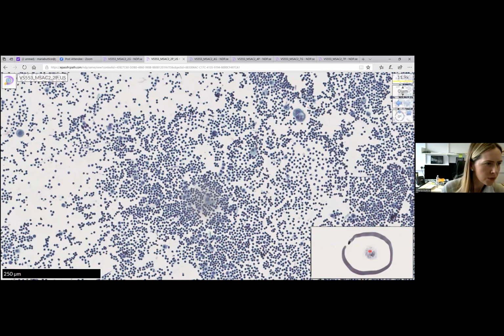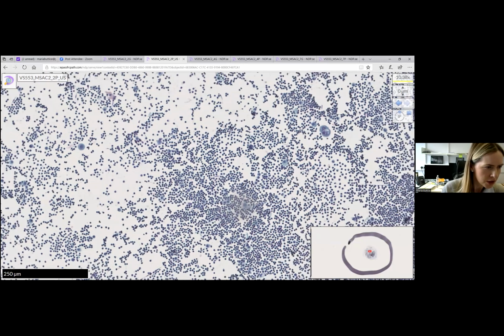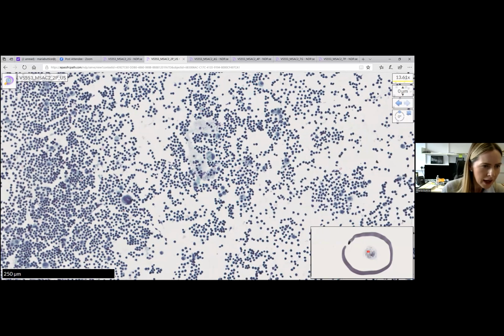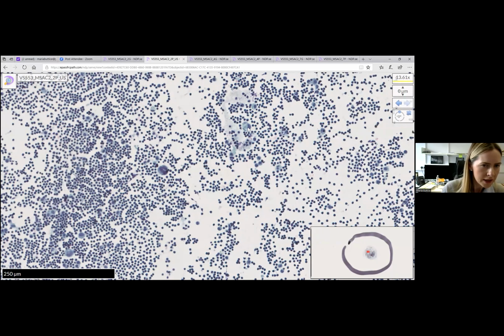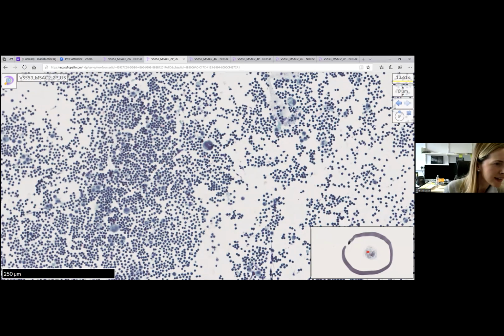So does anyone want to give some, yes, thank you very much, positive for malignant cells? Do you think we can go any further on what type of malignancy this may be and why? So just reminding of the cytomorphology. Fantastic. Yes, great answers. Well done.